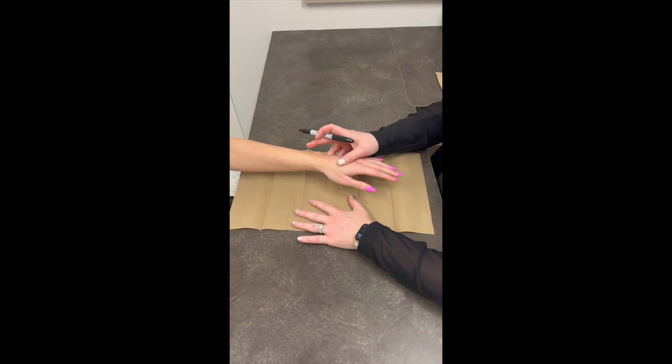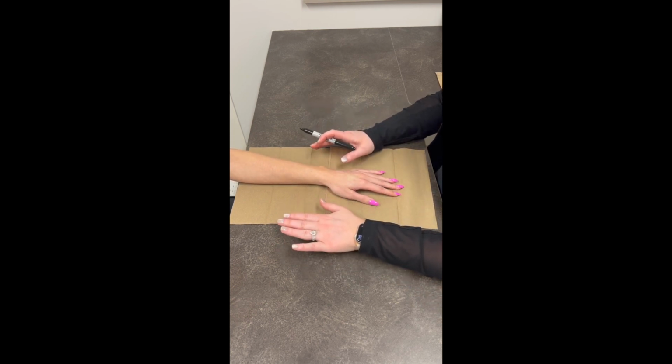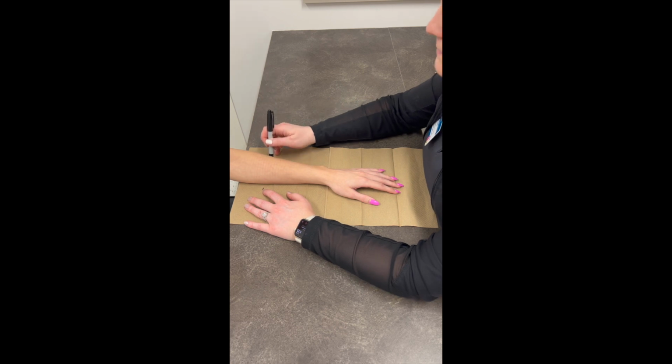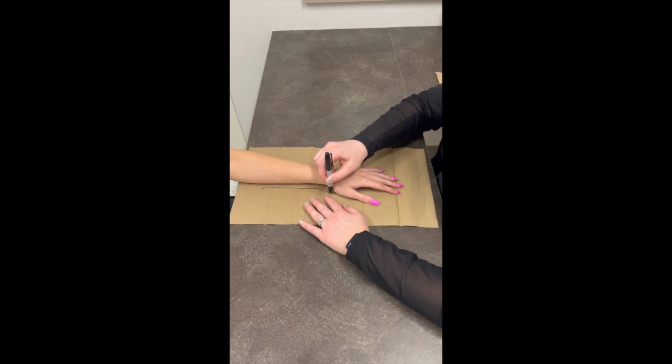So you're gonna place your paper towel down on the table, place the patient's arm down on the table in pronation, and then we're gonna start by outlining the hand and the forearm. So we're gonna go about 2/3 the way down on the forearm and mark that. And then we're gonna start by outlining everything.